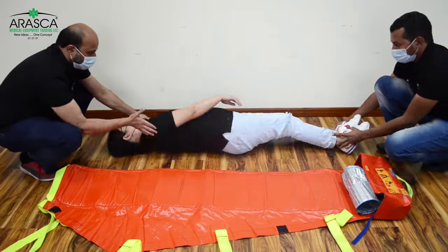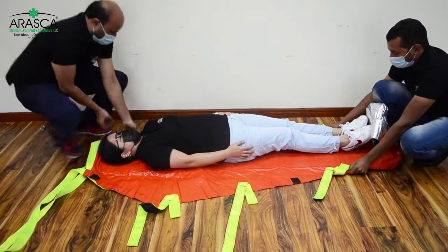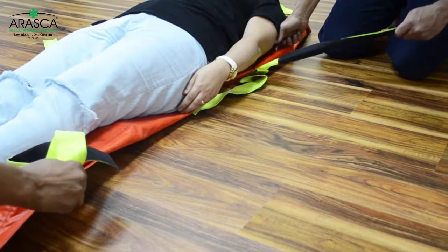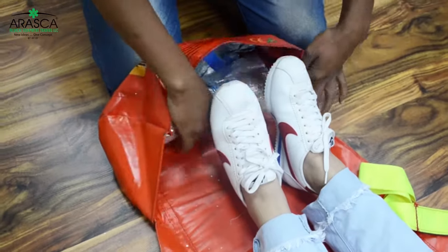Responders can easily carry the mat and load the patient by folding one flap underneath, sliding that folded side under the patient's body, and then pulling the folded flaps so the patient's body is centered.